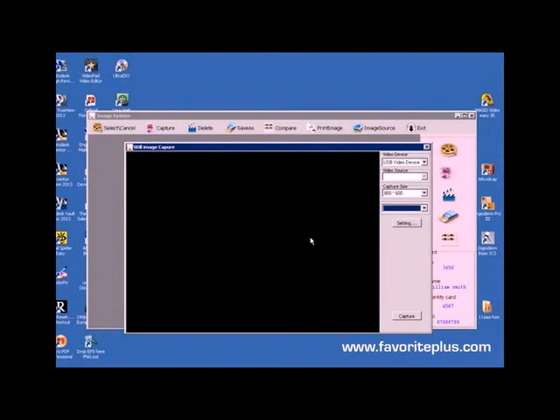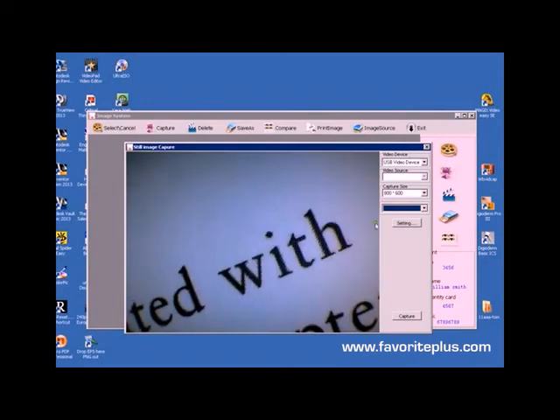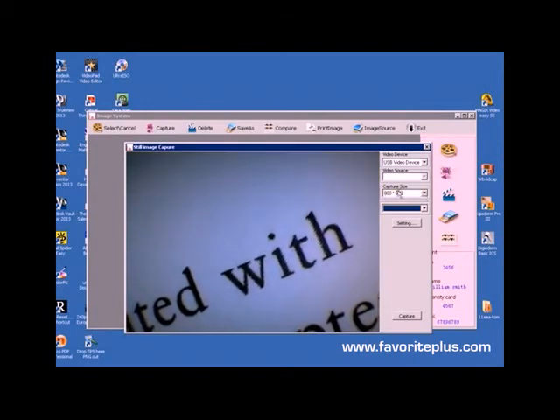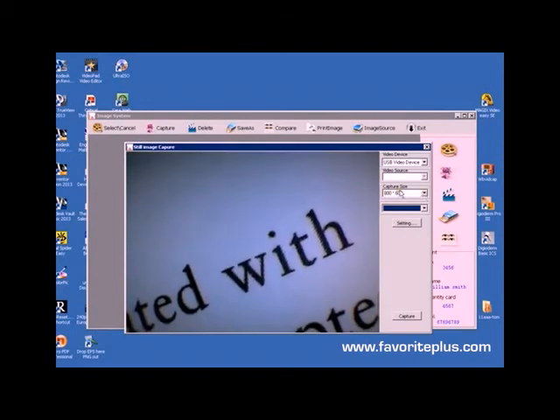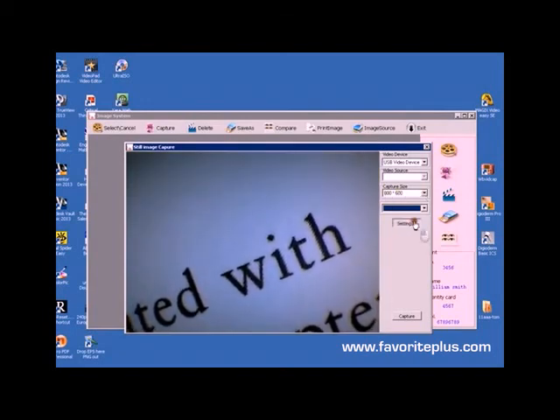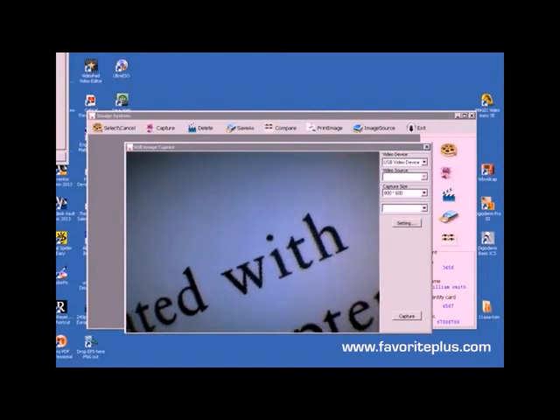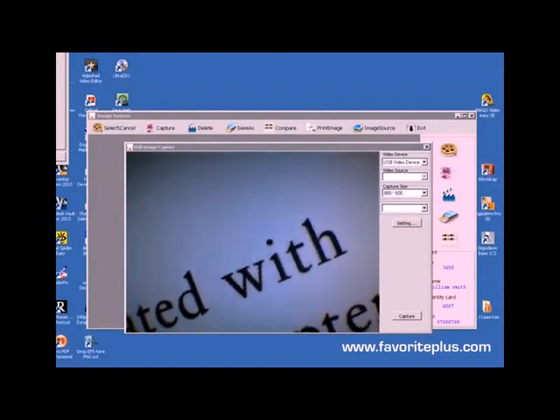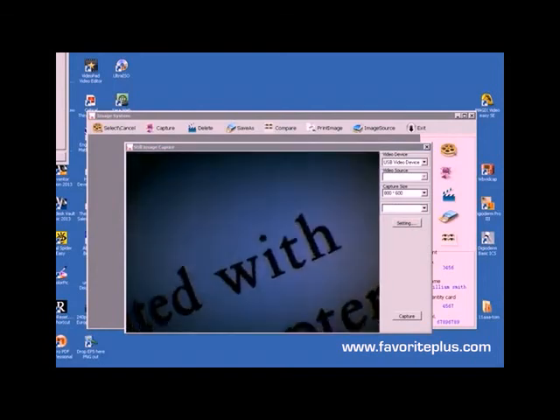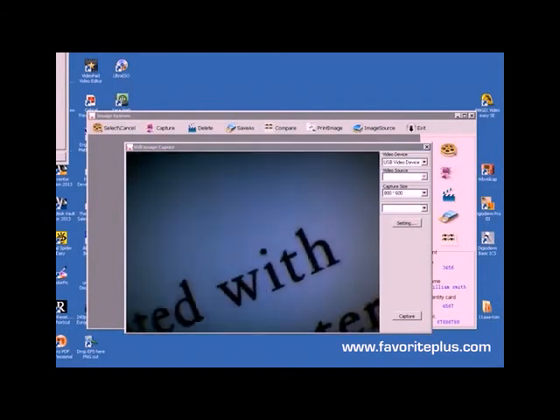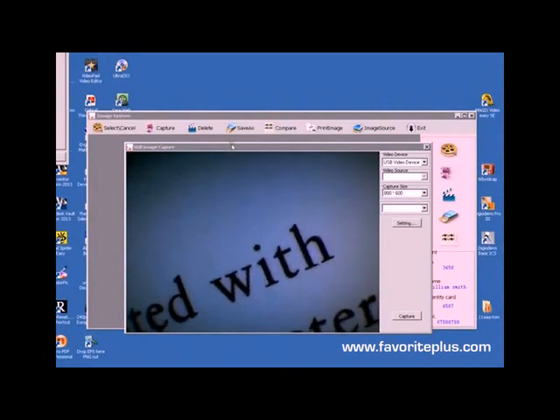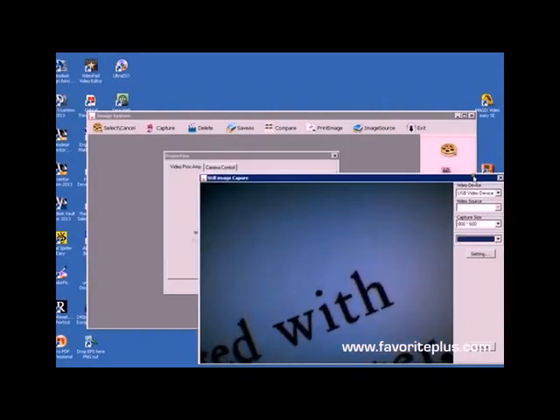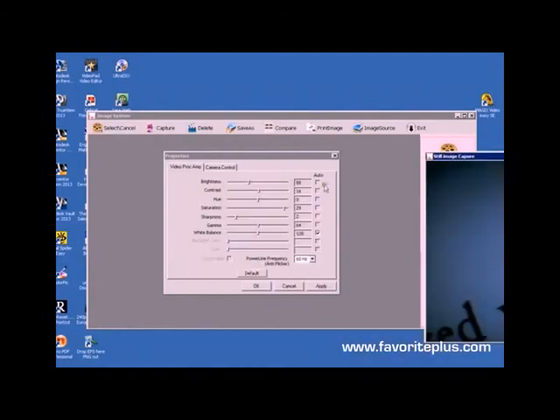You can also change the output size here. What's also important is that you can change the settings. Sometimes there's a bit too much glare, so what you do is you bring up this box by clicking settings.